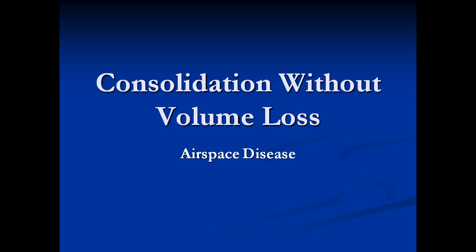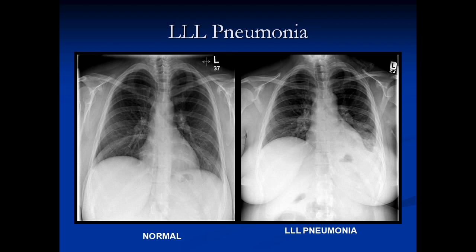Here we have a patient's normal chest x-ray on the left side. On the right side we have lost the diaphragm completely — if you look through the heart, you can tell there's white stuff back there, and this is consolidation. There's an air bronchogram going down there and no volume loss, so this is what a left lower lobe pneumonia looks like.